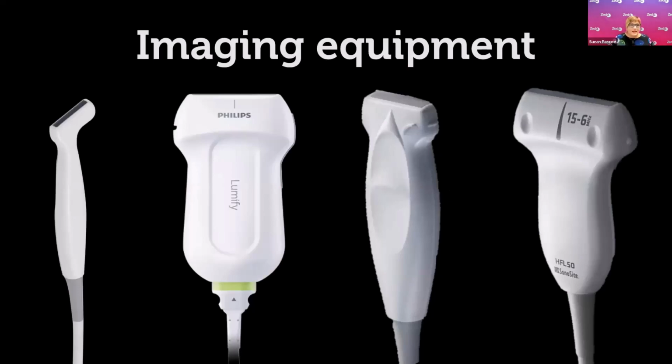Now, when we're talking about ultrasound probes here, you need to use a linear probe. And if you have the fortune of having different linear probes to choose from, use the highest frequency linear probe that you can, because we'll get better resolution near the skin surface. And the other thing to think about here is the size of the footprint. If I'm scanning a finger and I have a hockey stick probe available, as indicated over here on the left, I'd rather use the hockey stick because it's much easier to hold and to maneuver around a tiny little surface area. Sometimes, though, you don't have a choice, so you just have to use what you've got in front of you.